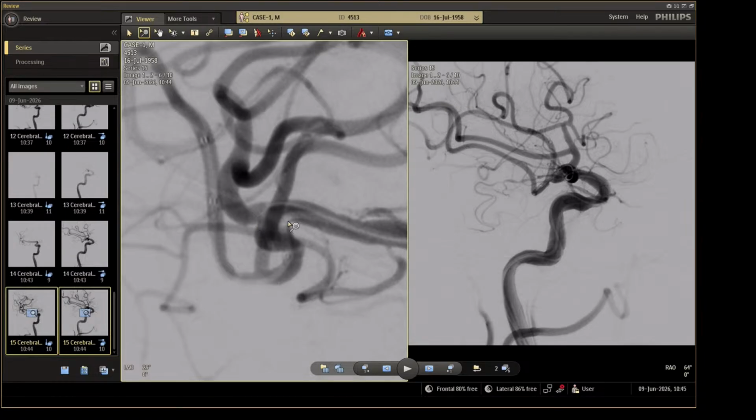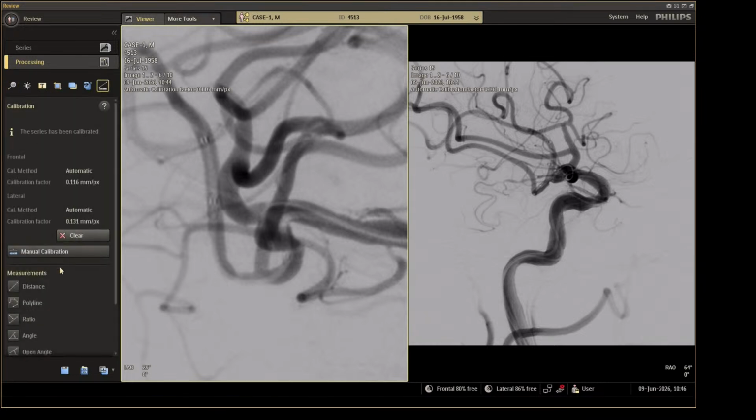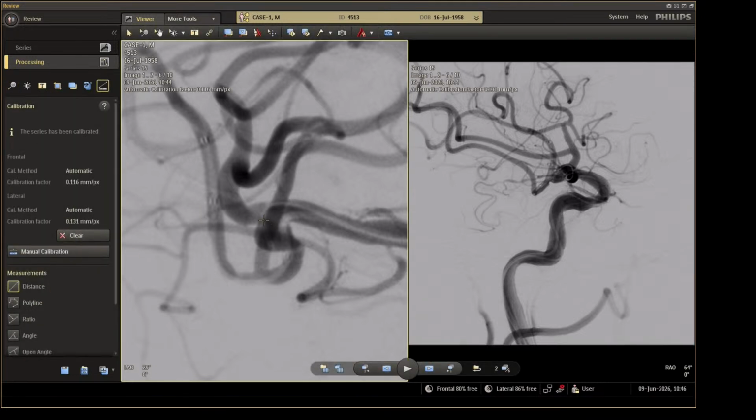This point I think is very important because it's a neck of the aneurysm. It's entrance zone 2.9, and the stent will be... We can place it as a half T stenting, just finish at this level, not to change the angulation. 2.9. We can take little baby.